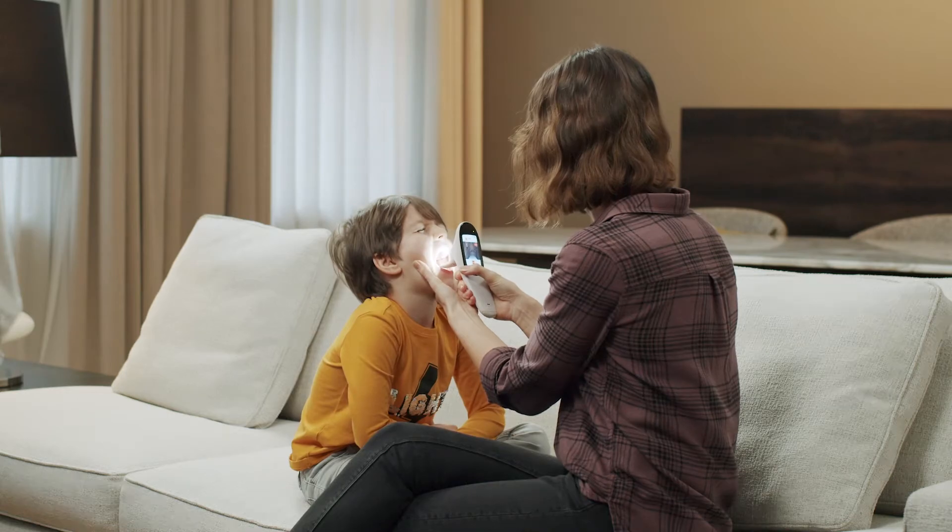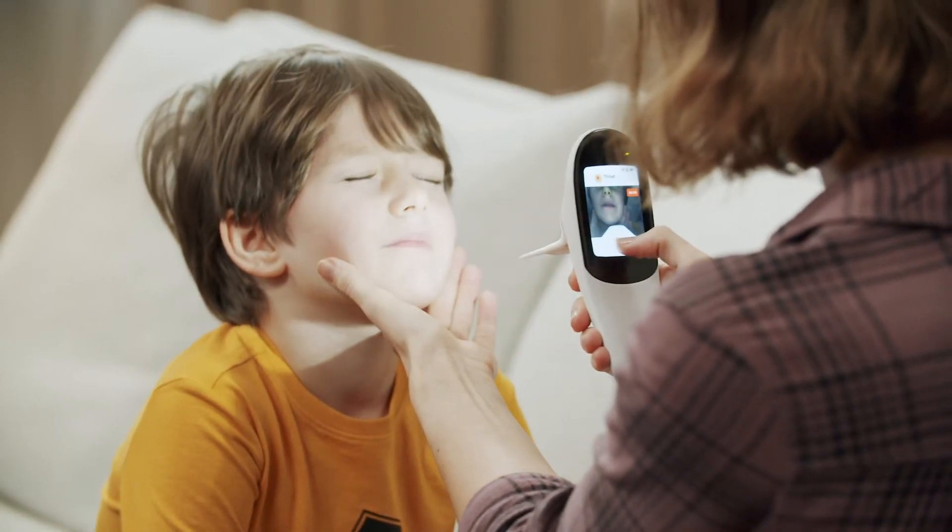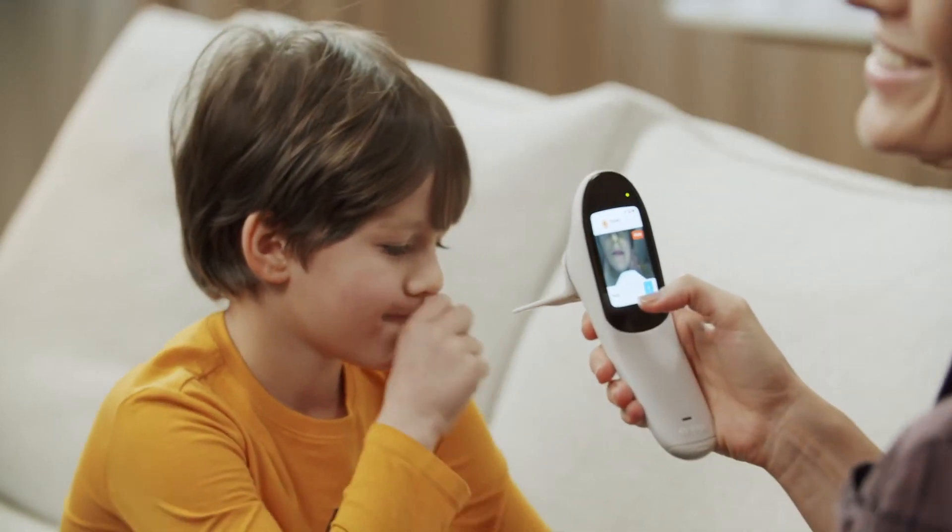Place one hand on the patient's lower jaw — this helps you control the patient's head movements. Ask the patient to open his mouth as wide as possible and say "ah." Place the spatula on the tongue, reaching up to 3 fourths of its visible length.